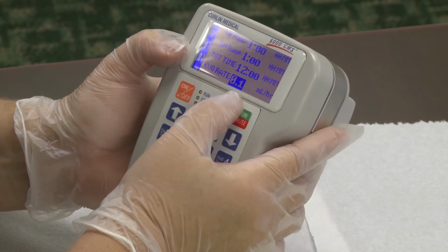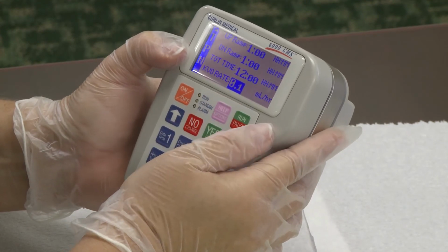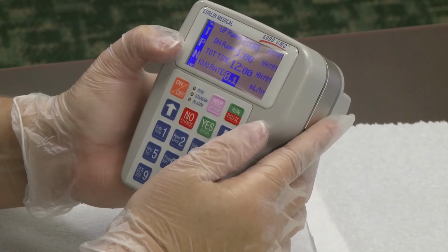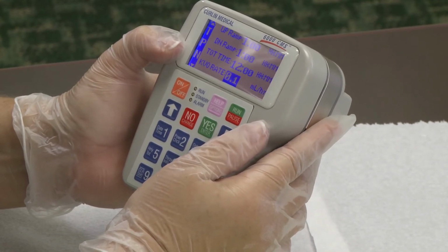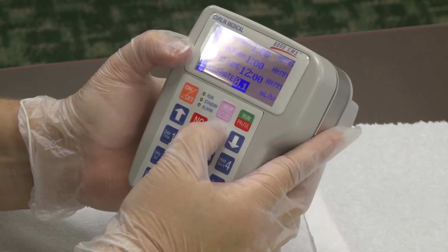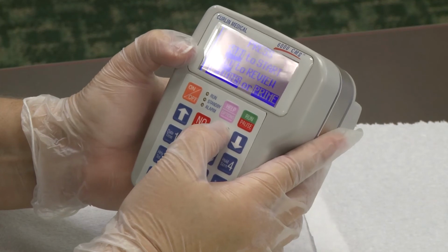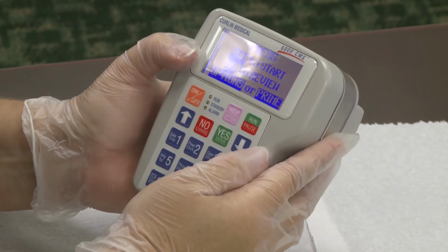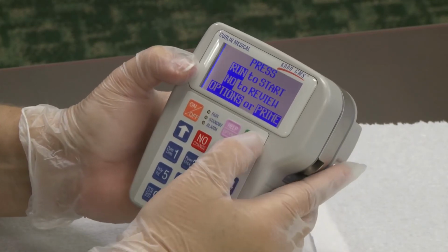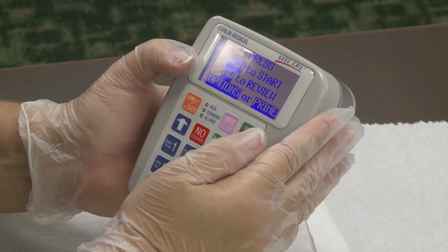KVO rate of 0.1 means at the very end, when it's all finished, it's going to run very slowly at that 0.1 until you're ready to stop the pump and flush your line. That's why the extra 40 cc's was in there from the total bag volume. I'll say yes to that. Am I done? Yes. Now it's back to the very beginning screen that says it's ready to press run to start. And we'd be ready to do that after we put the tubing in it.